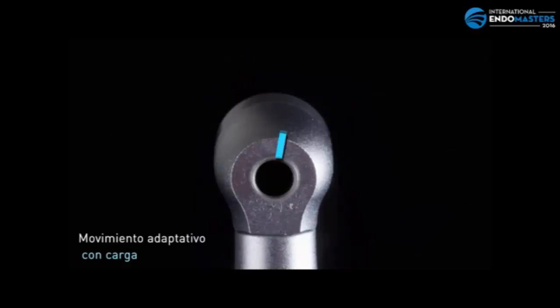This variation happens without being noted by the clinician because the motor has an internal chip that constantly receives feedback from the file that indicates the type of movement that should be used.